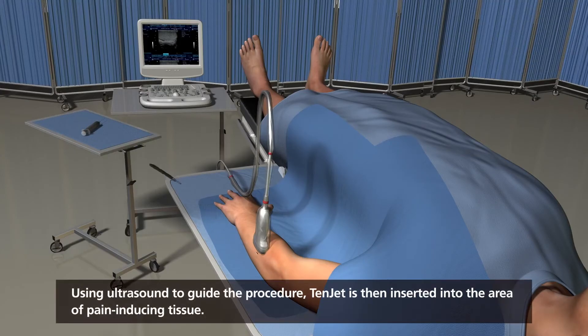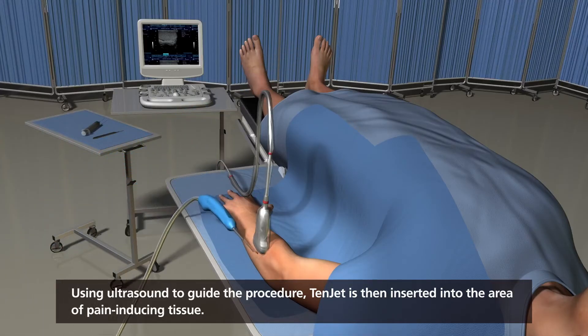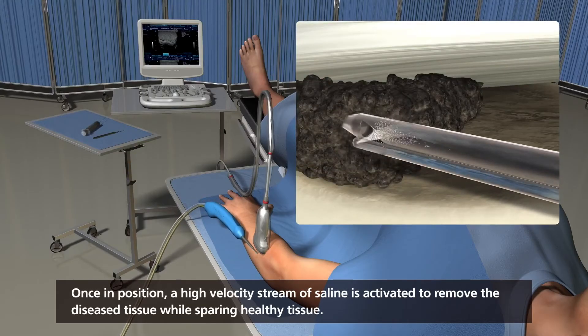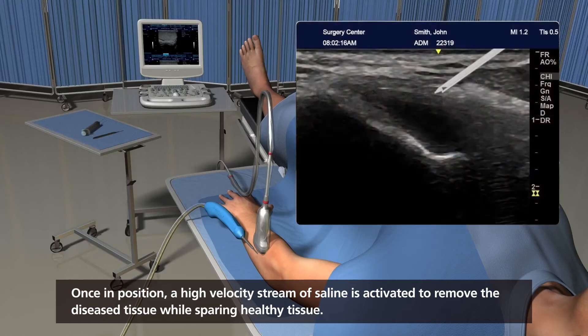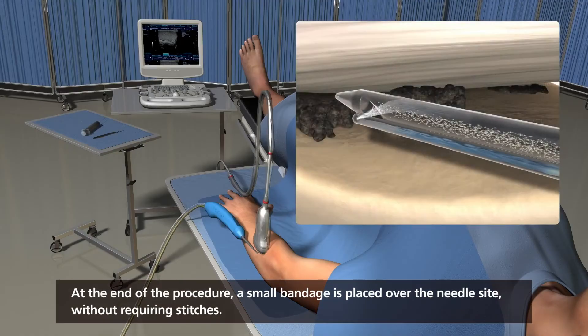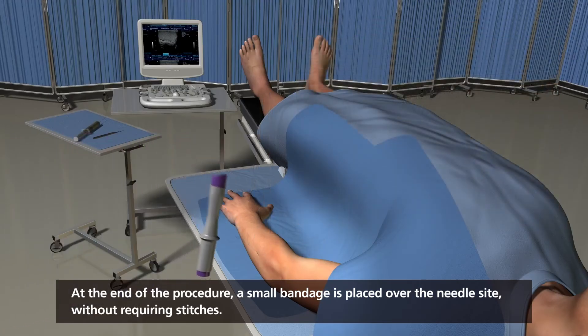Using ultrasound to guide the procedure, TENJET is then inserted into the area of pain-inducing tissue. Once in position, a high velocity stream of saline is activated to remove the diseased tissue while sparing healthy tissue. At the end of the procedure, a small bandage is placed over the needle site without requiring stitches.